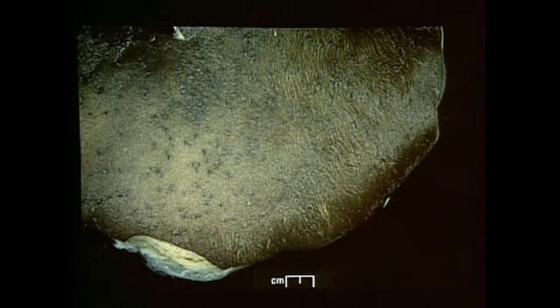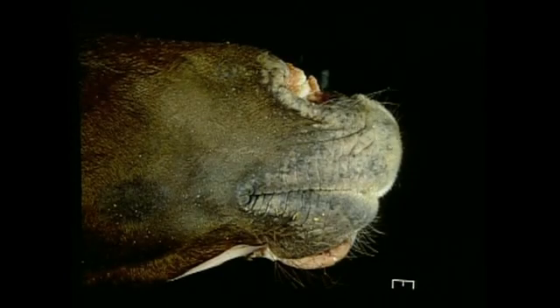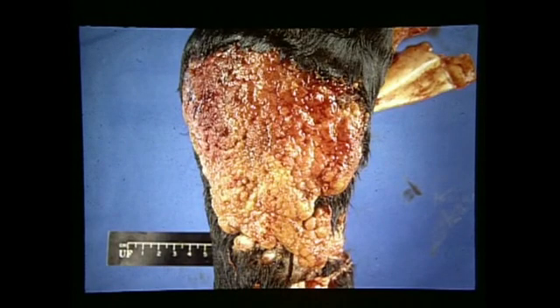And another one, characterized by small nodular elevations and alopecia, was diagnosed as Molluscum Contagiosum, yet another type of pox virus, that microscopically was characterized by these large vacuolic structures, ballooning structures really, of epidermal cells. This doesn't bring it up very well, but inclusion bodies were appreciated as well. A case of a tumor causing severe ulceration of the skin.